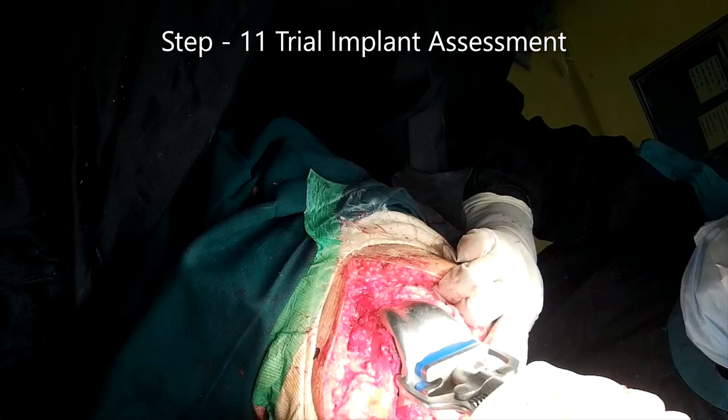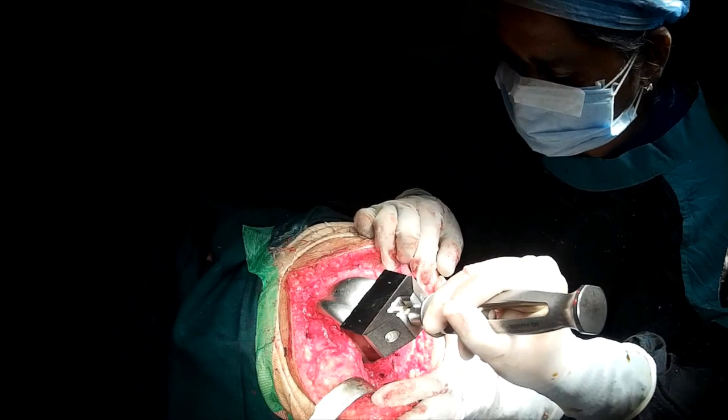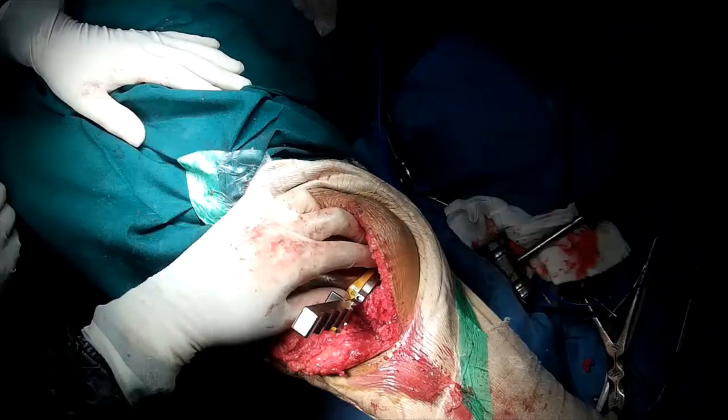Now trial femoral and tibial components are implanted and then alignment, varus valgus stability, extension, patellofemoral tracking, anteroposterior stability and range of motion is assessed.